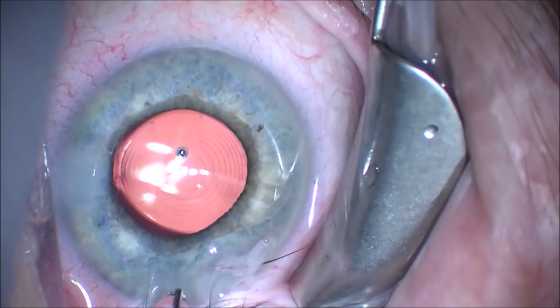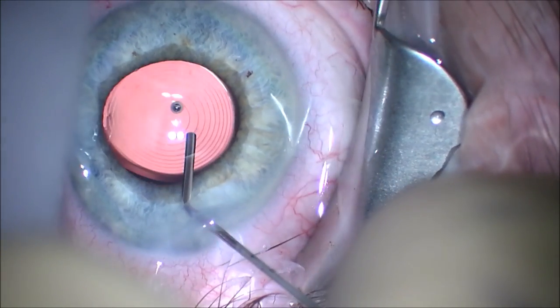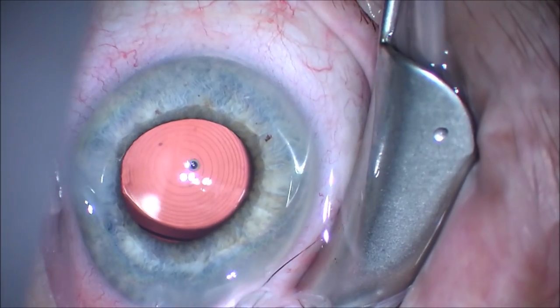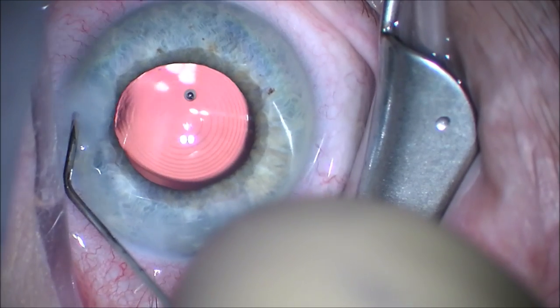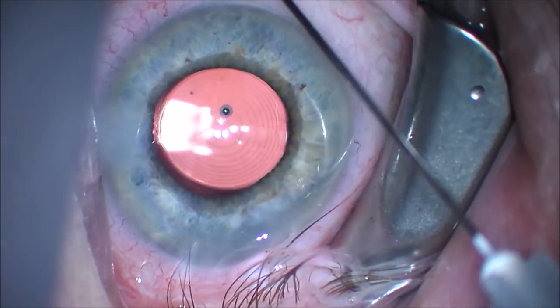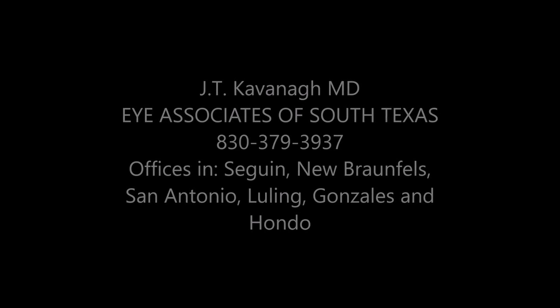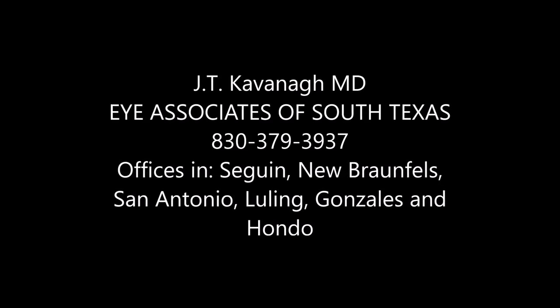We want to check centration of the intraocular lens. It's important to make sure this is well-centered. Even though the Symphony depth of focus lens is more forgiving on decentration than other multifocal lenses, it's important to have it well-centered. You can see here, looking at the images of the microscope lights, it is perfectly centered. Thank you for your attention. This is Dr. Kavanagh of Eye Associates of South Texas.